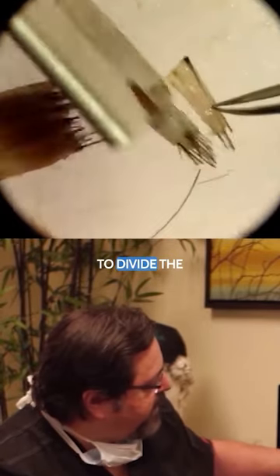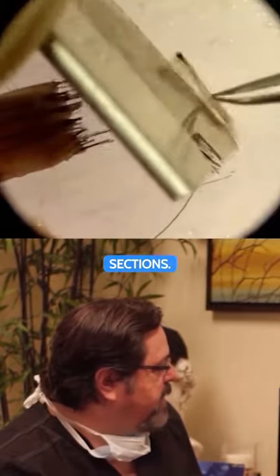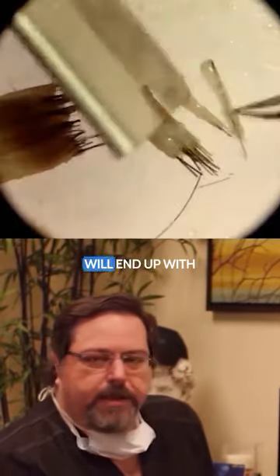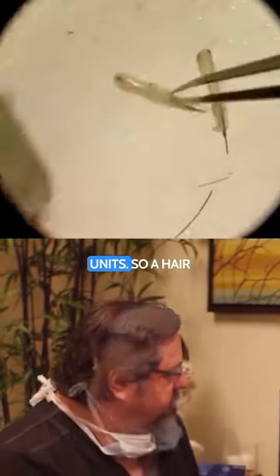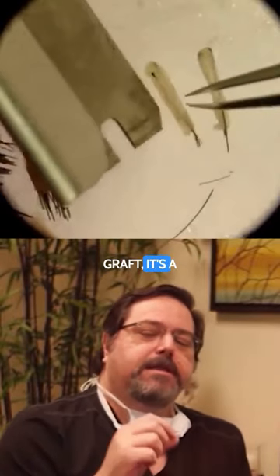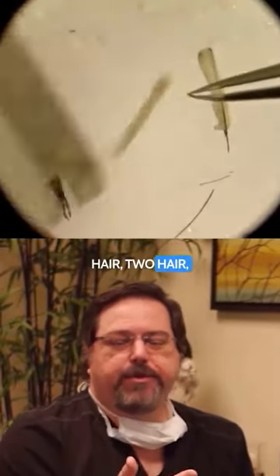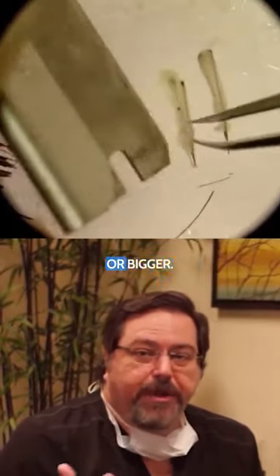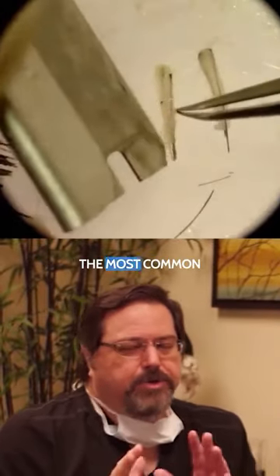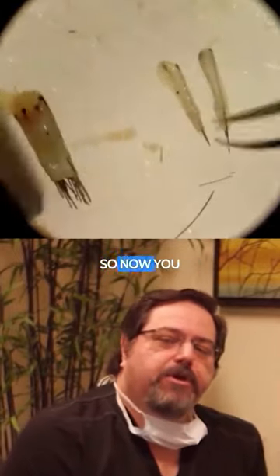We start to divide the strip into smaller and smaller sections, and eventually we wind up with the follicular units. A hair graft is a group of hairs — it could be one hair, two hairs, three hairs; I've seen even seven. The most common follicular units are two and three hairs.